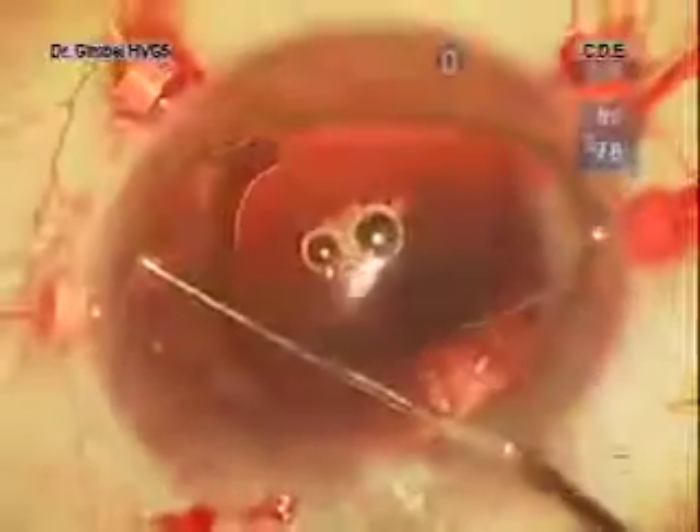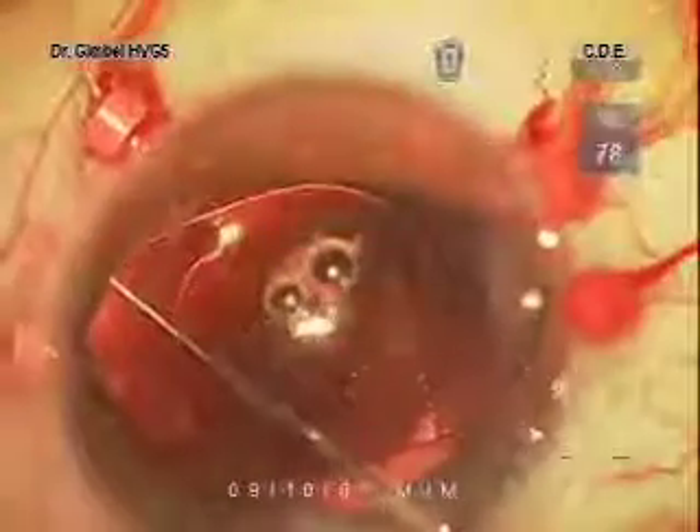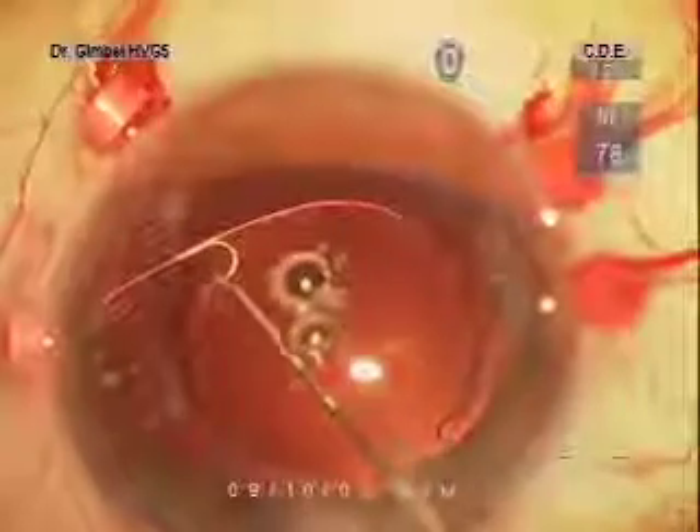The alternatives in this case would be to remove the lens and replace it with an anterior chamber lens, but that would take a large incision. Another option would be to suture the haptics to the sclera or to the iris, but I would argue that the membrane is the ideal fixation for any intraocular lens.